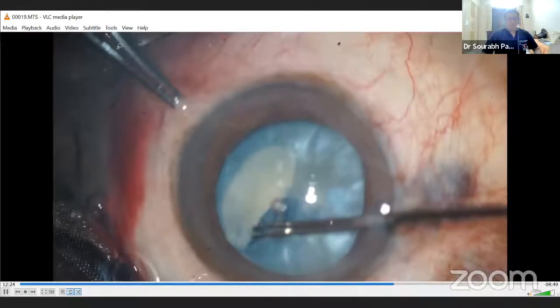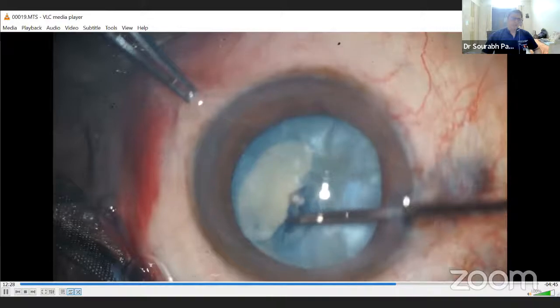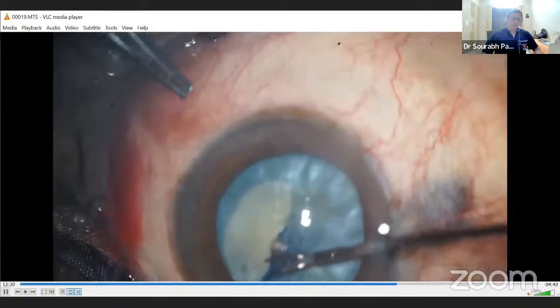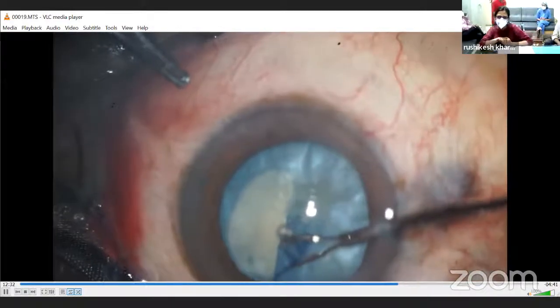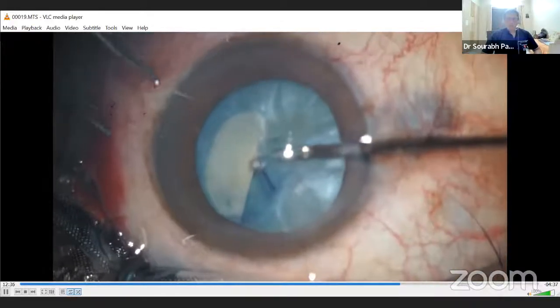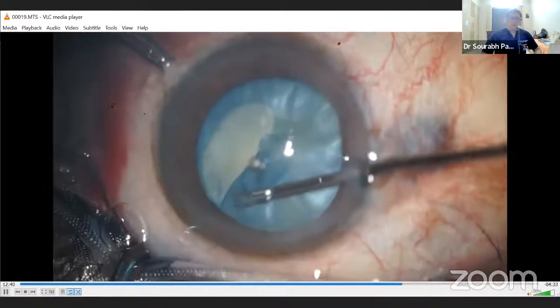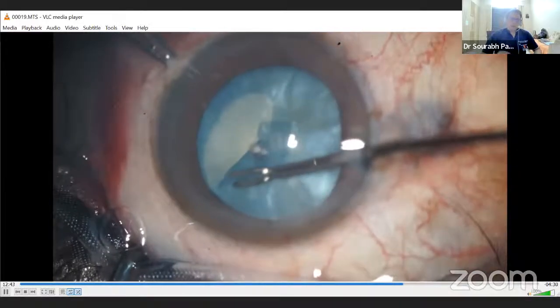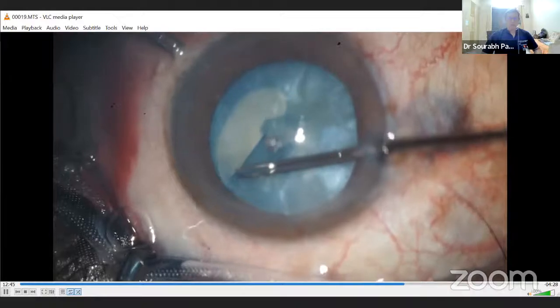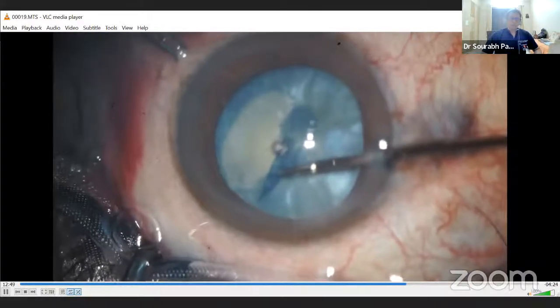Short jerks and it brings it in quickly. But still it is outside, it's not coming. Yeah, so you need to pull it very quickly and fast. Then it comes in, because it's very rare to have this capsulorhexis going behind. It usually stops in the zonular area.